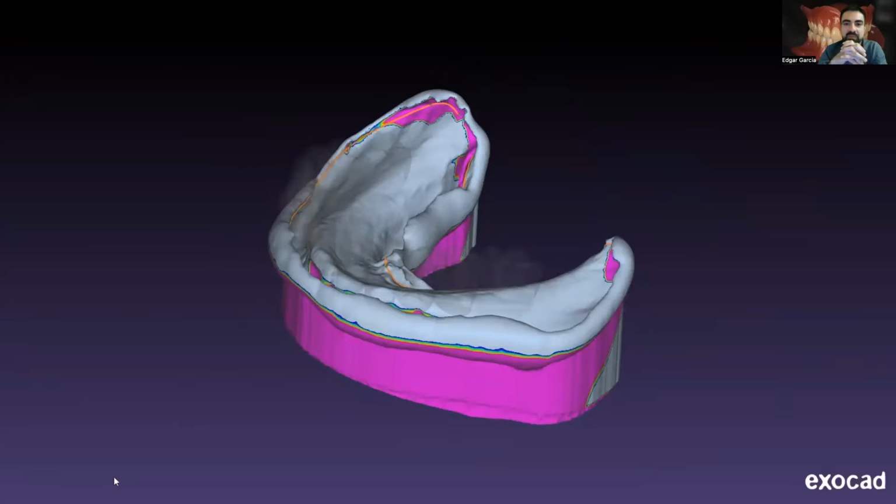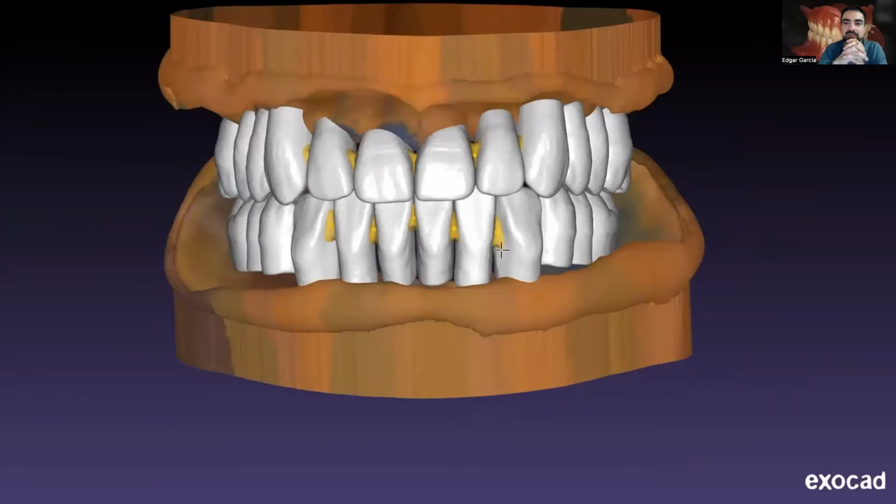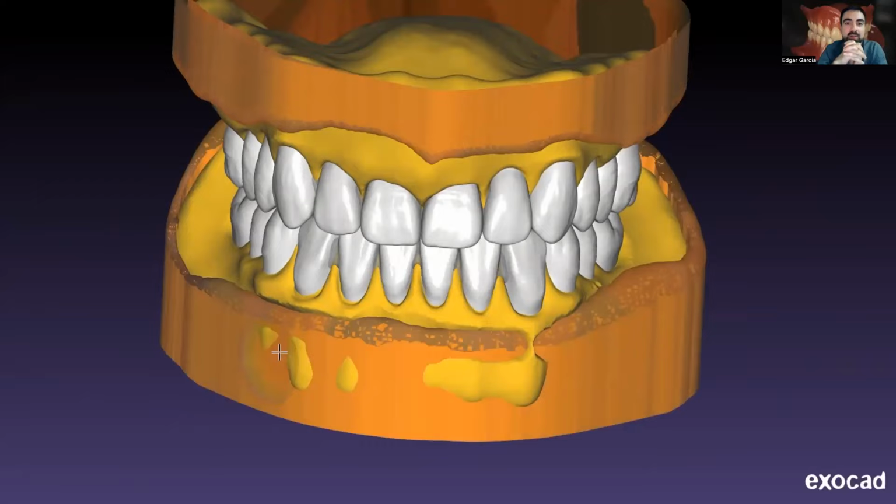As you can see, we do not use cast models, model cast. We don't mount. But you did use a cast model after your alginate impressions. Exactly. That's the only cast model that you use.